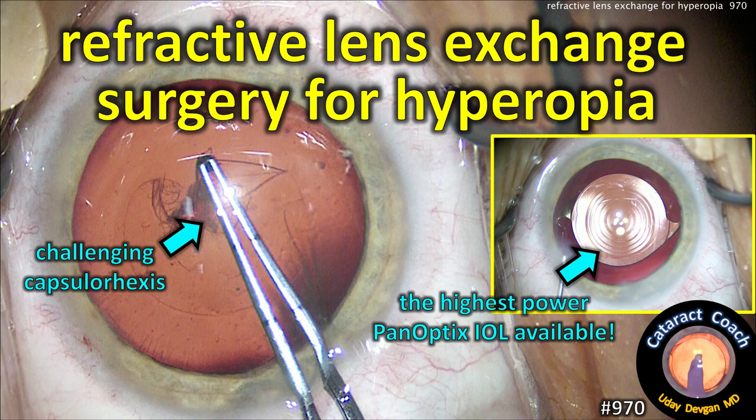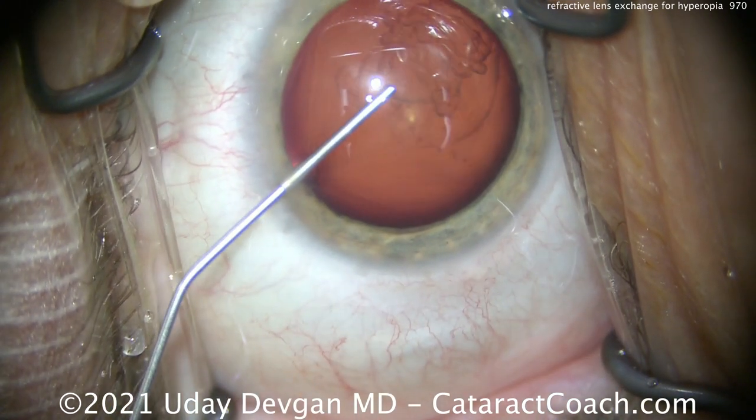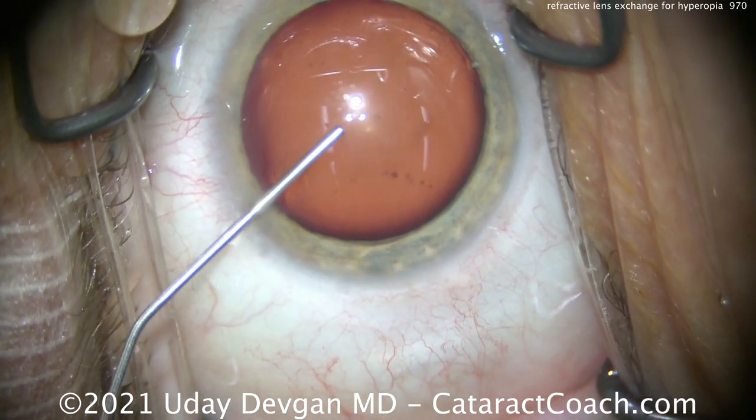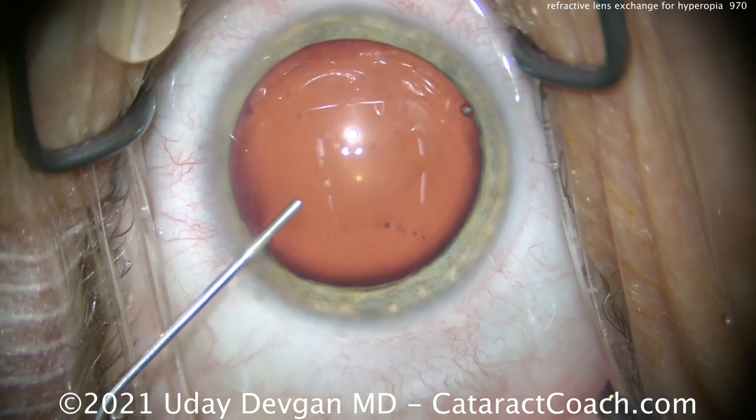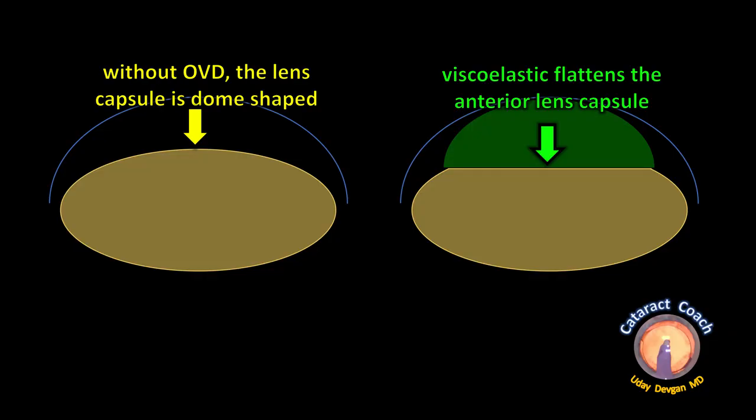CataractCoach.com — Refractive Lens Exchange Surgery for Hyperopia. One of the big challenges is creating the capsulorrhexis. Remember, these are small hyperopic eyes with a shallow anterior chamber, and the anterior lens capsule is very curved. We put a lot of viscoelastic in order to flatten it. Without OVD, the lens capsule is dome-shaped, but by injecting dispersive viscoelastic we can flatten the anterior lens capsule.